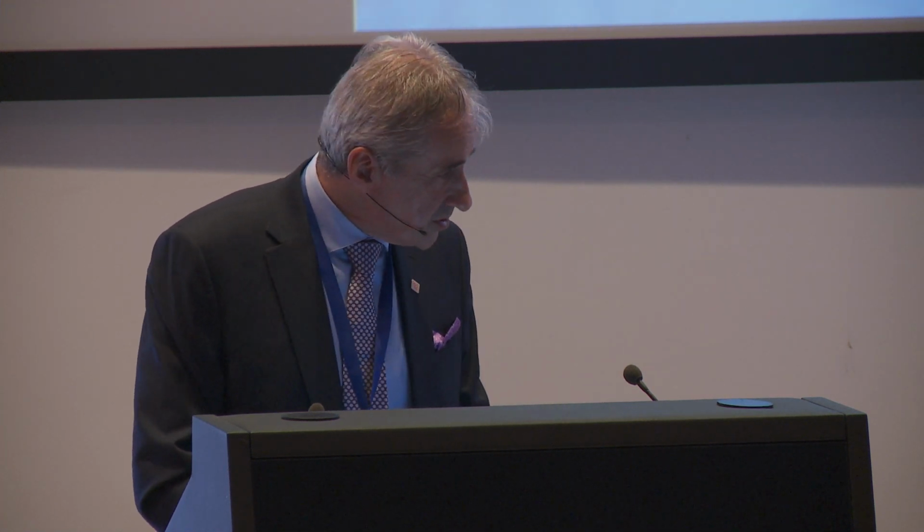Probably transeptal is now prevailing, but I still like for some indications to go retrogradely because first I'm used to it because I did all former accessory pathways on left side more or less retrogradely. And second, really for some locations of the substrate or focus, it's better, but sometimes you have to use both. So I think it should be individualized decision.